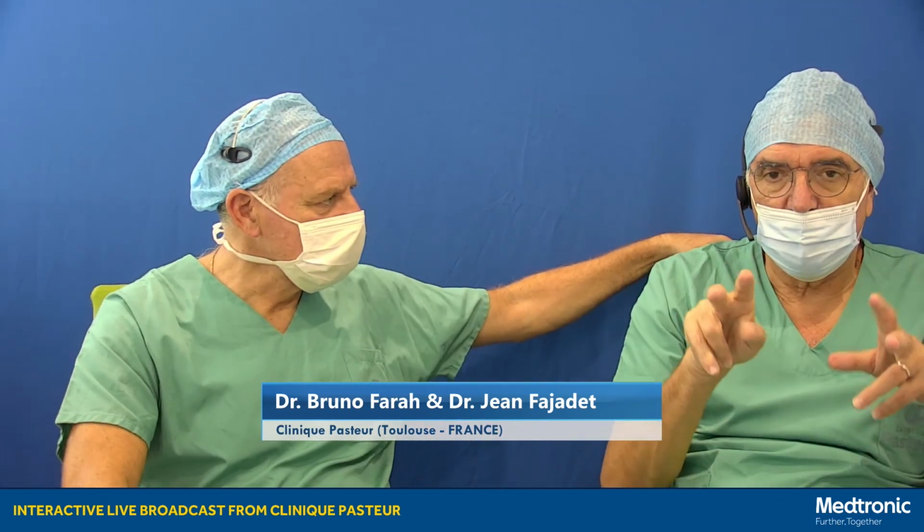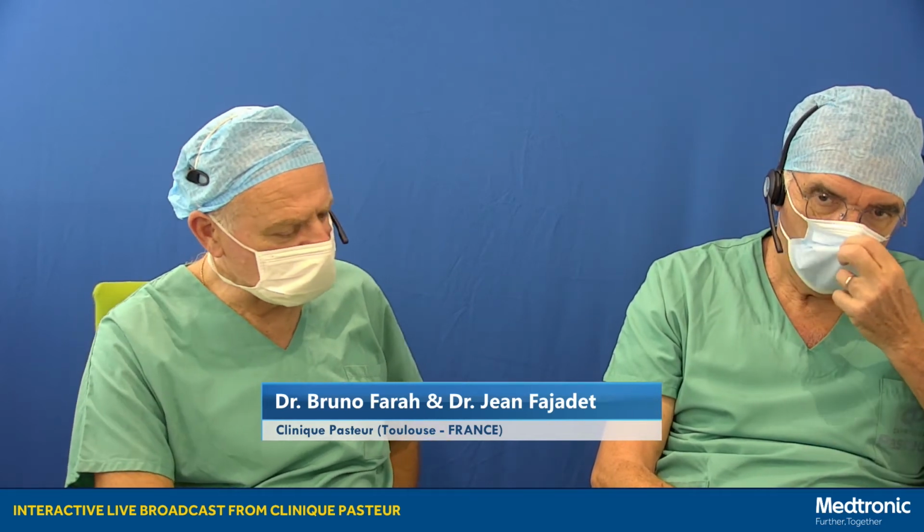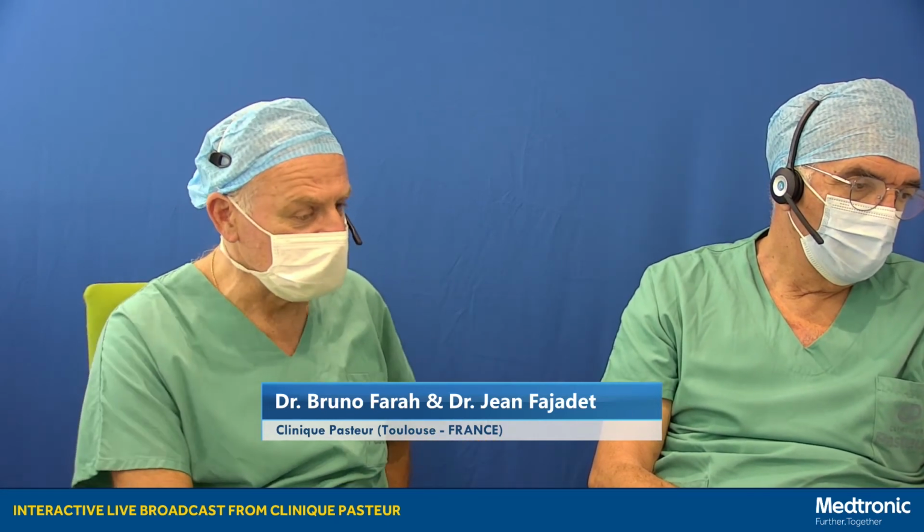The difficulty is when you have a complex bifurcation with overlapping stents, where I hesitate all the time. Remember, this is a diabetic patient, so probably the thrombotic risk is a bit higher. But here, hopefully, we can treat this with only 2 last generation stents, where we know that even 1 month of DAPT is quite satisfying. So I think that here we are quite comfortable.